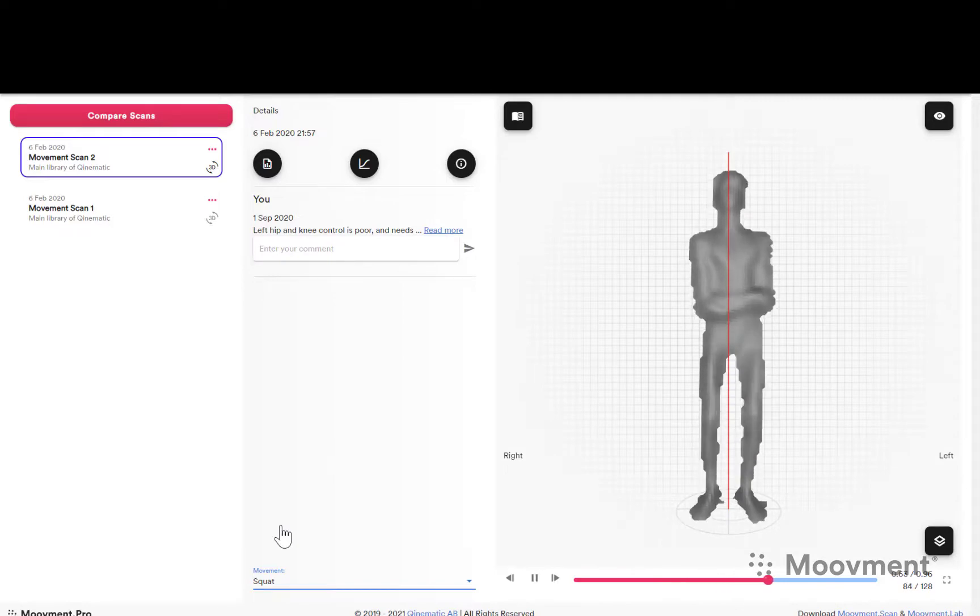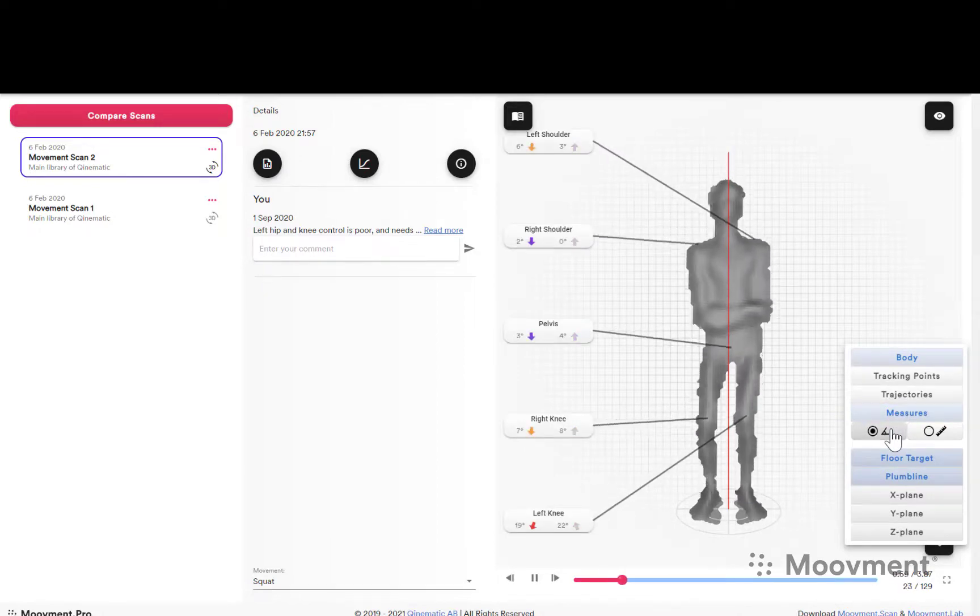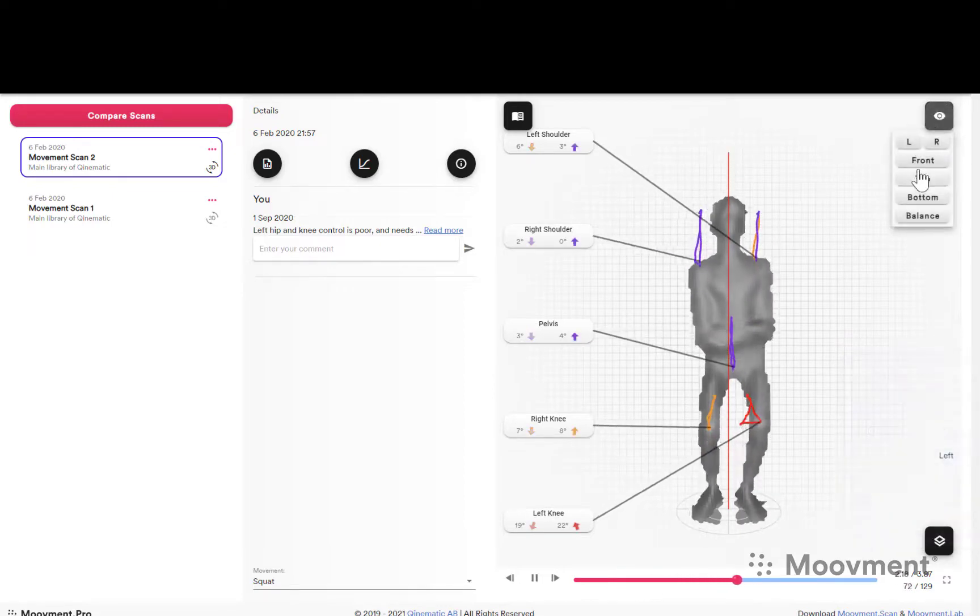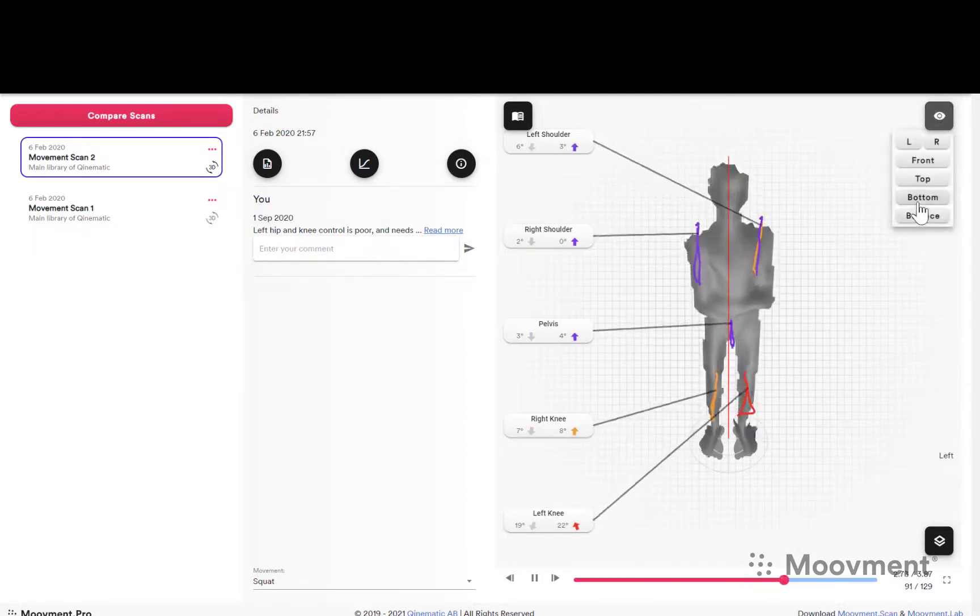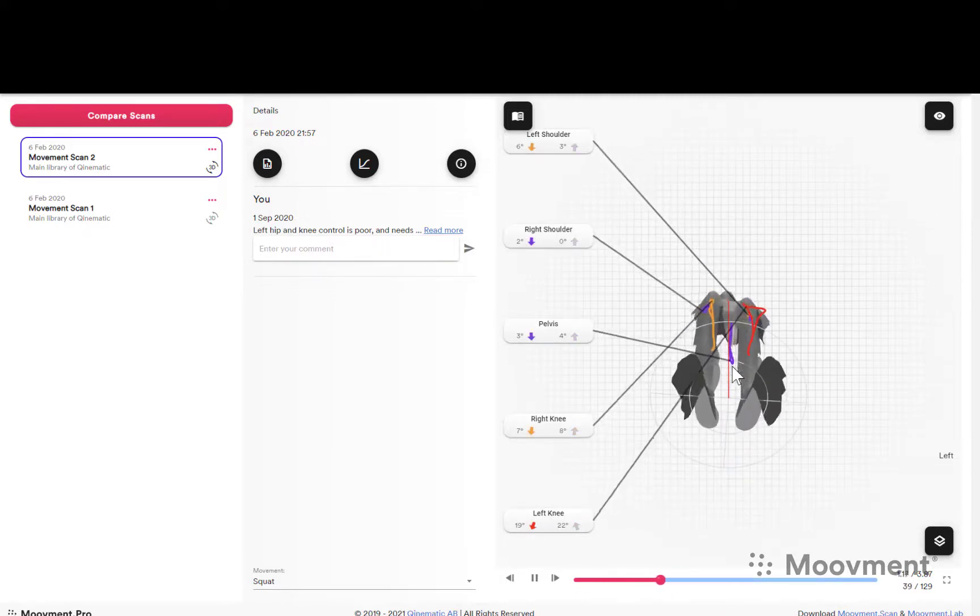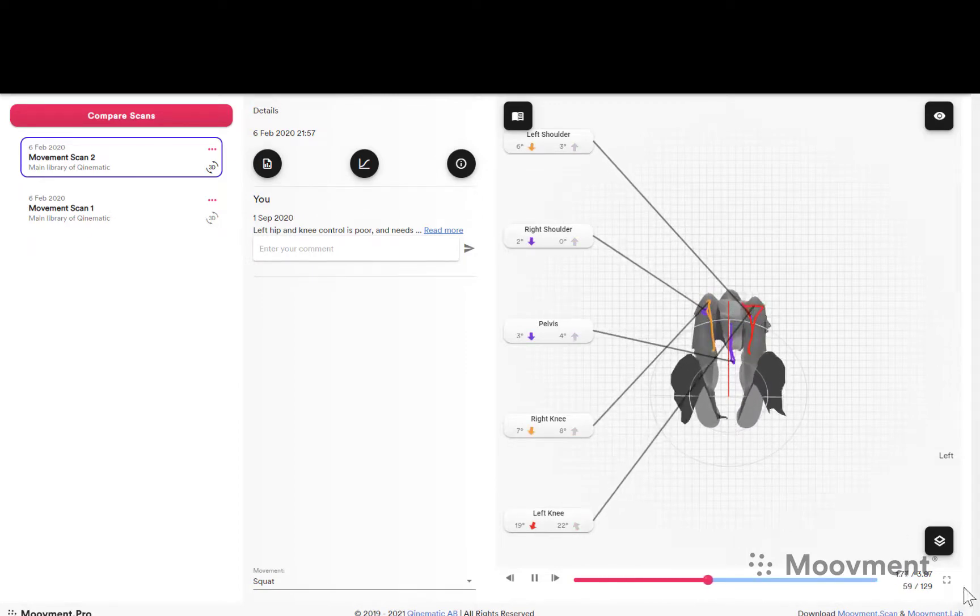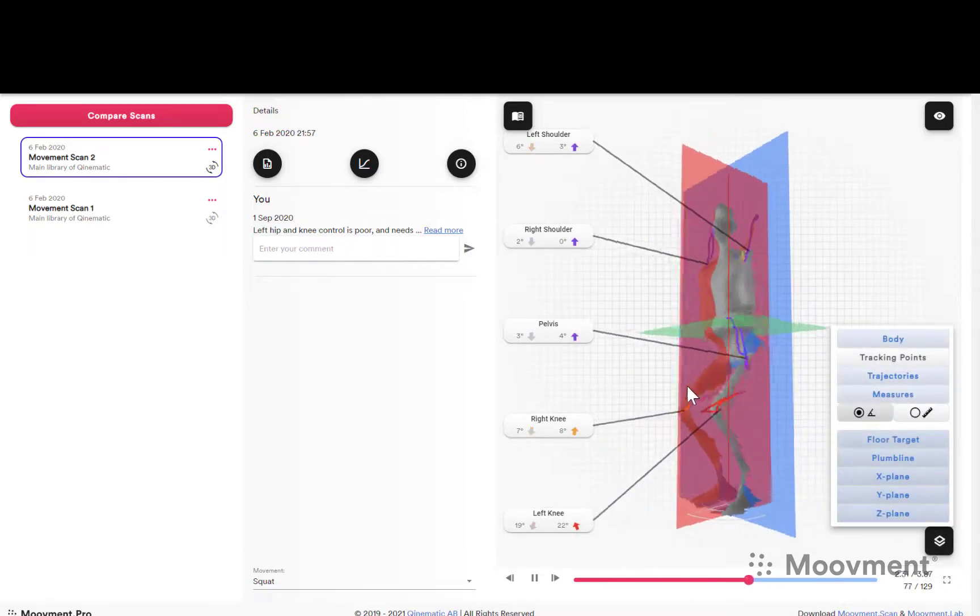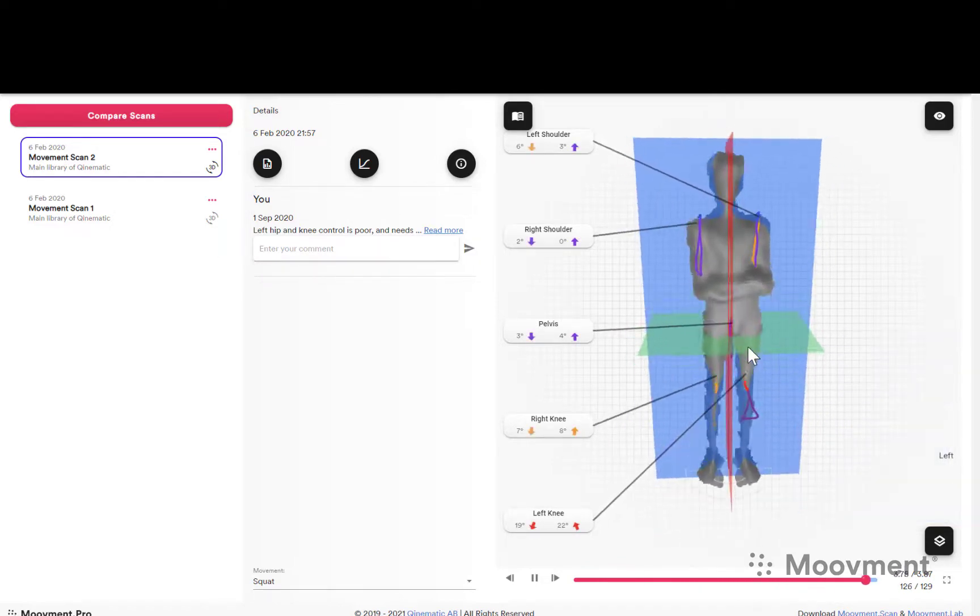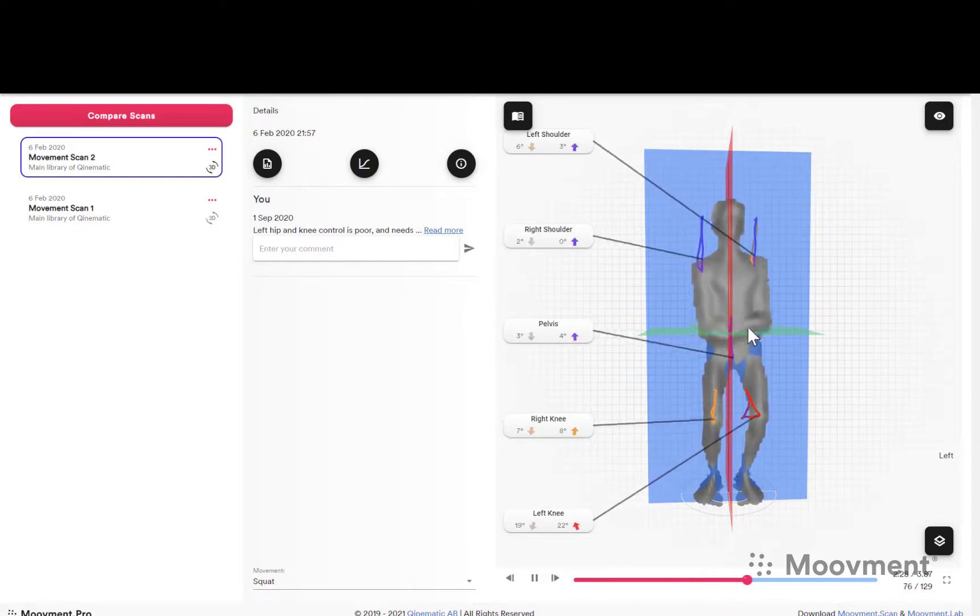This gives us the opportunity to bring up the measurements during the performance, also to bring up the trajectories which we saw before, to look at multiple views. And these views will give us different perspectives in order to analyze the quality of movement from different angles. If you want to enhance this, you can bring in the XYZ planes of movement or the frontal, transverse, and sagittal planes of movement, which is very good for teaching purposes and for educating patients who are interested in this sort of thing.